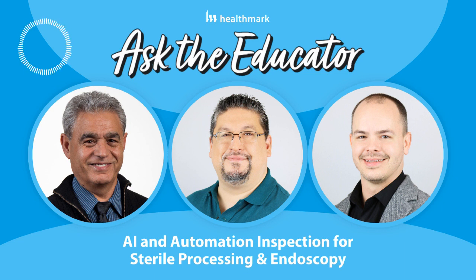I love that definition you gave, and the Olympus example where it says to visually inspect for debris, but how do you see inside without, say, a borescope? We need tools like that at our disposal to assist with those types of things. But can you talk a little bit about the standards and guidelines that also tell us we should be using a borescope to inspect these things?